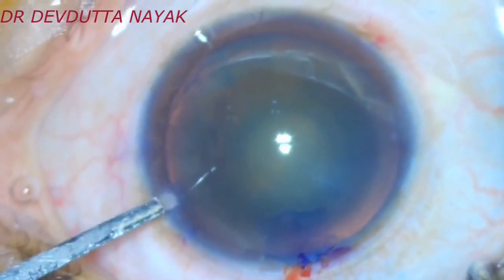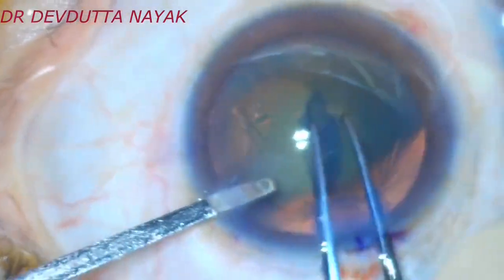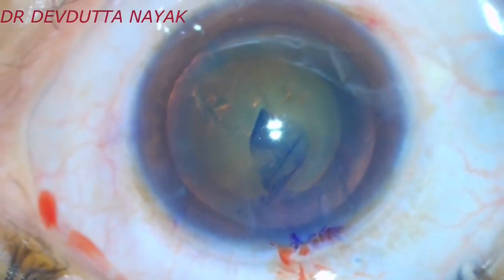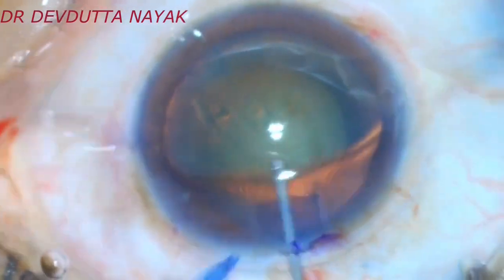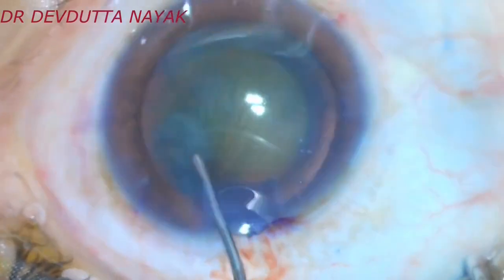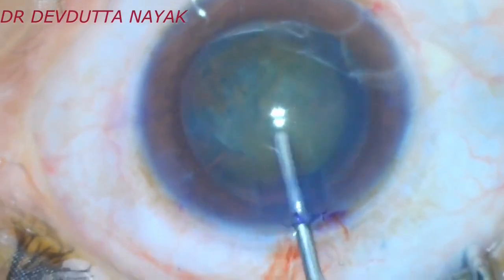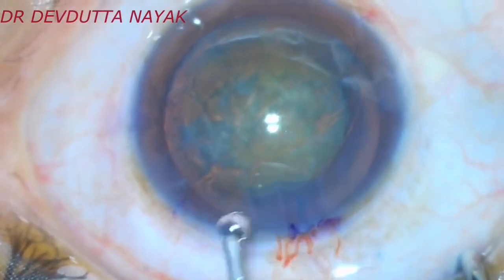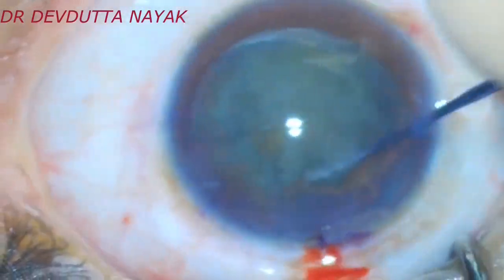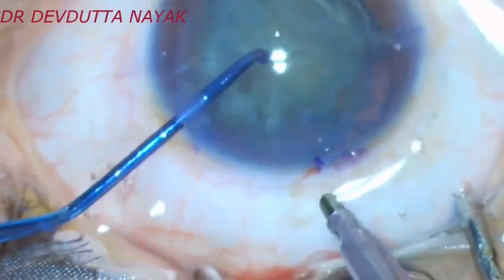A 5 millimeter continuous curvilinear capsulorhexis is being done with the help of Utrata forceps. Multi-quadrant hydrodissection is done. Then we inject some Hylucoat, and underneath that we inject some 2% HPMC. So that is the modified soft shell technique of Arshinoff to protect the endothelium. Nucleus is rotated just to be sure that there is no posterior corticocapsular adhesion.